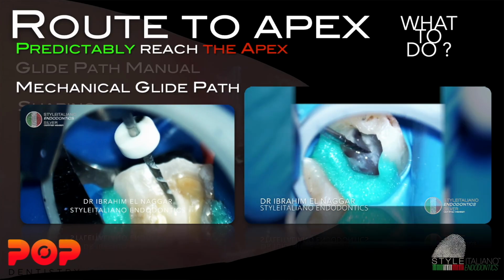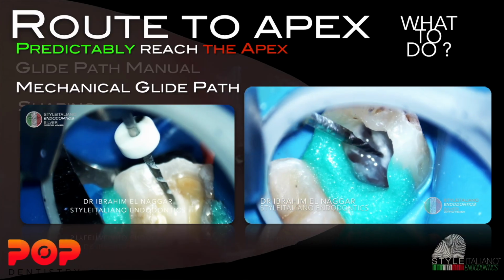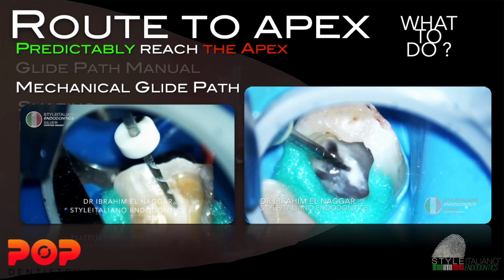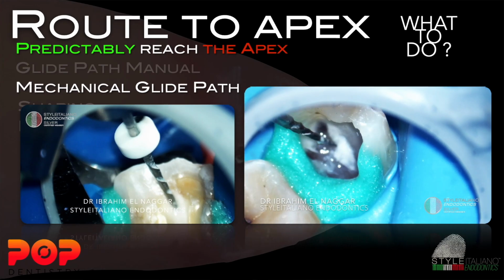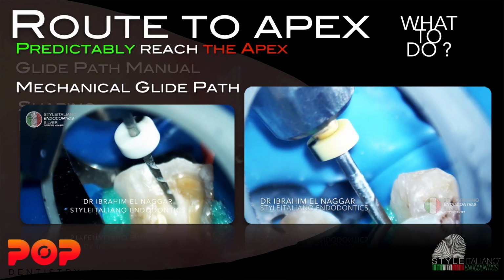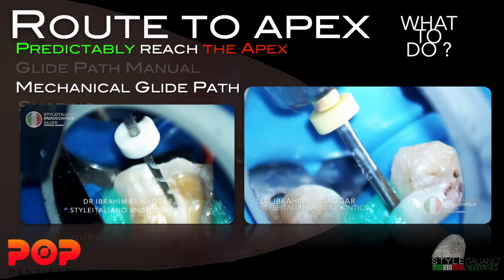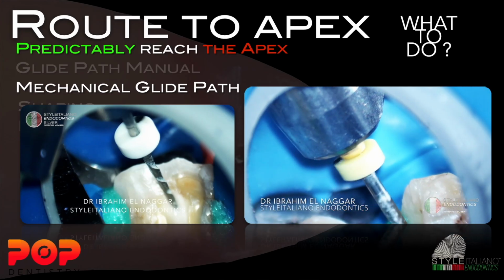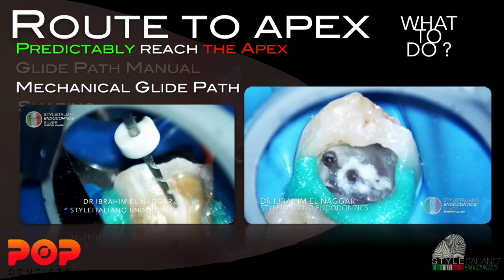Okay, we went directly with the rotary, taking advantage of the taper of the instruments. So we did pre-enlargement because it was impossible to enter this canal using just manual files. As you can see, with no brushing, just letting the instrument flow in and out, in and out, and we now have the orifice of the MB2.